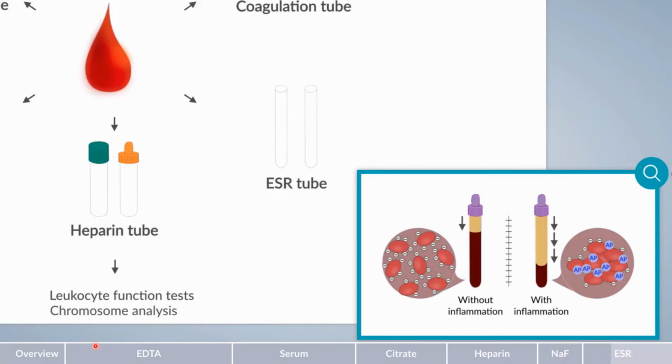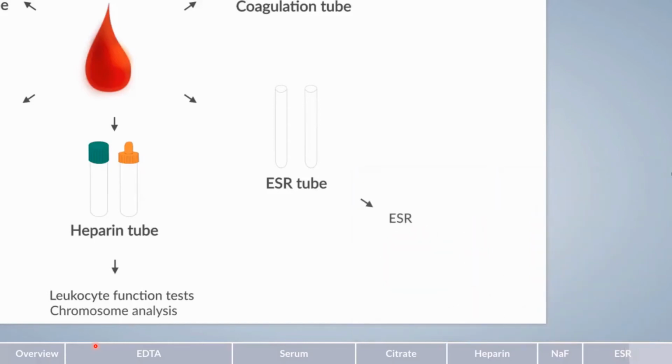As a result, the red blood cells do not repel each other and therefore form large aggregates, sinking to the bottom of the tube. Because the ESR not only depends on serum protein composition but also other parameters, results are only of significance if rates greatly differ from the normal reference values. ESR measurement can only be performed in anticoagulated blood. Therefore, the anticoagulant citrate is also used in ESR tubes.